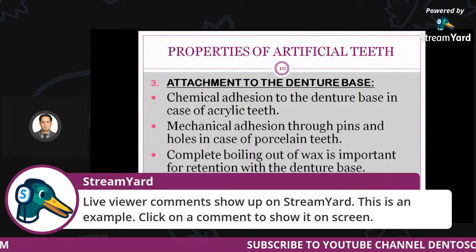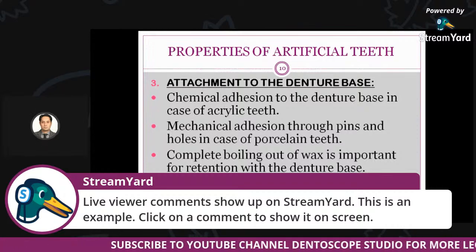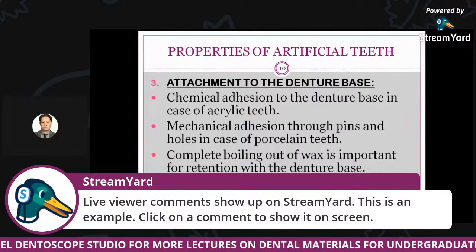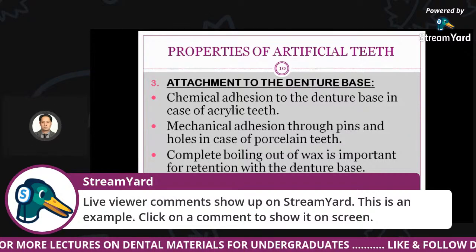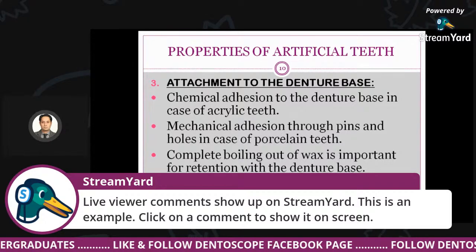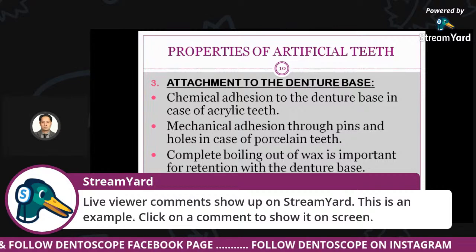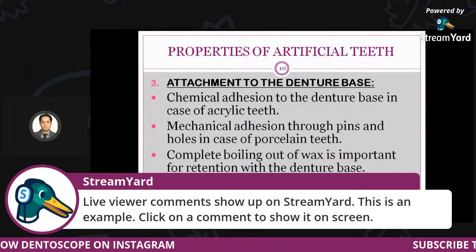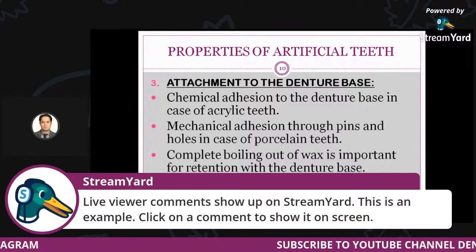So the chemical adhesion is seen between the acrylic artificial teeth and the acrylic denture base, as both have the same chemical composition.